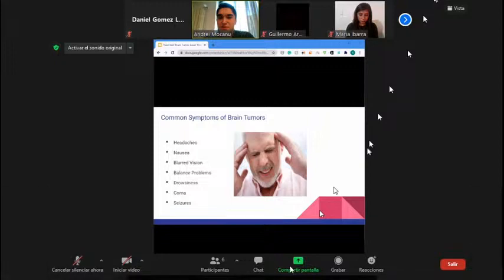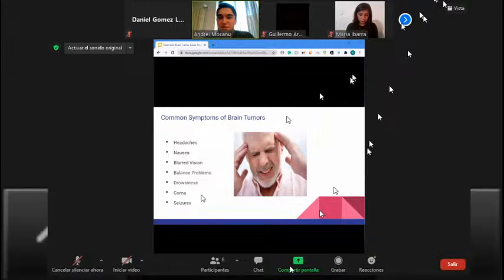A minimal amount of hair is shaved from the incision area, and a small incision is marked out. The area is cleaned and draped in a sterile fashion, and then an opening in the skull about the size of a quarter, called the burr hole, is made, and the covering of the brain, the dura, is opened. A stereotactic biopsy needle with a soft-nosed blunt tip is introduced to the target using the neural navigation system and biopsy samples are obtained.